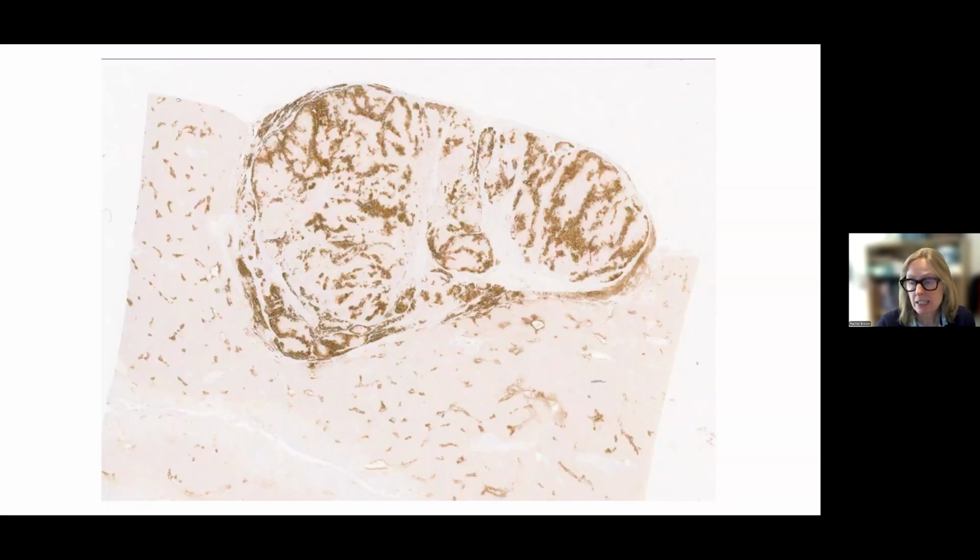So this is the glutamine synthetase stain, and I think it's a nice example of map-like staining. That means just exactly as it would suggest: it's like looking at continents on a map, if I can convince you of that. So map-like staining with glutamine synthetase, as opposed to the background liver where you get staining around the central vein. That's what you see in the background liver.